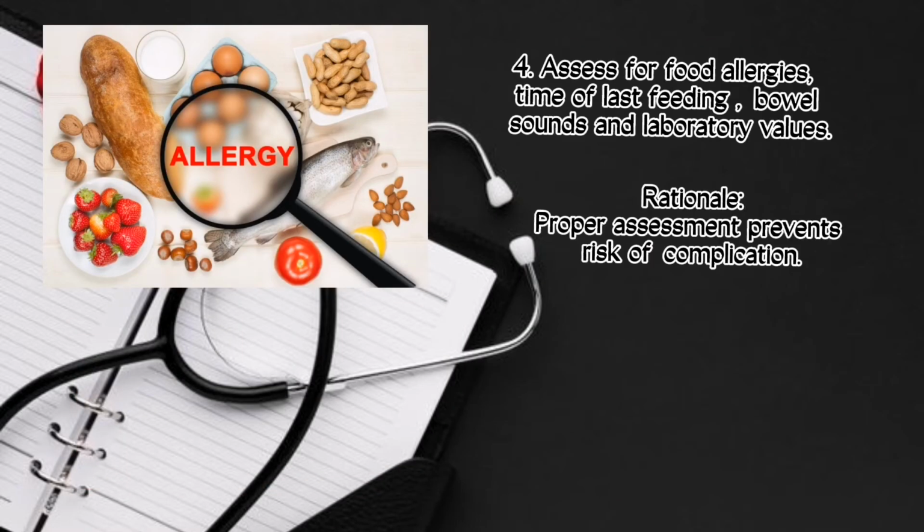Yes po. The fourth procedure is to assess for food allergies, time of last feeding, bowel sounds, and laboratory values. Proper assessment prevents risk of complication.